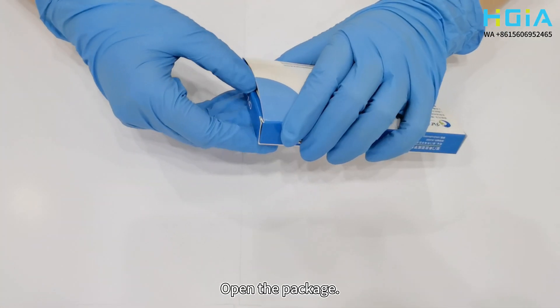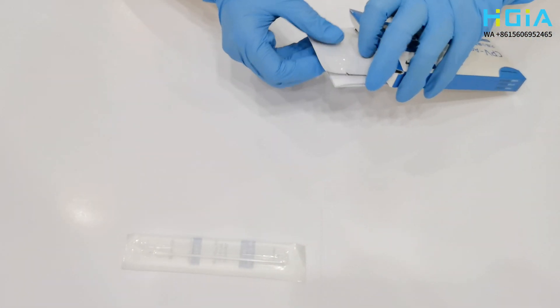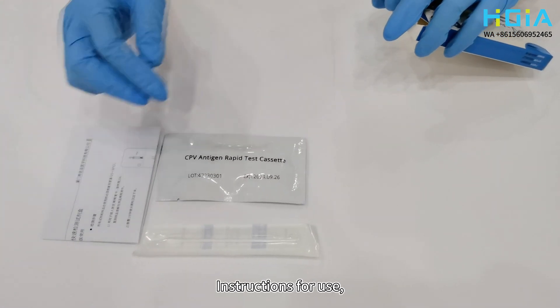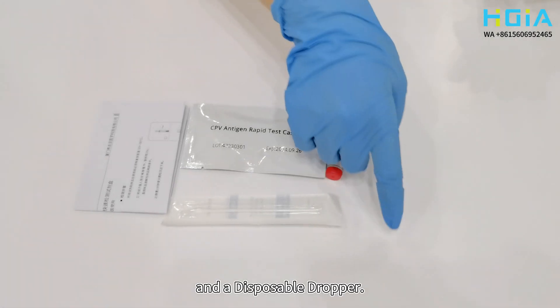Open the package and take out the components. The components include a disposable swab, a test card, instructions for use, a specimen diluent tube, and a disposable dropper.